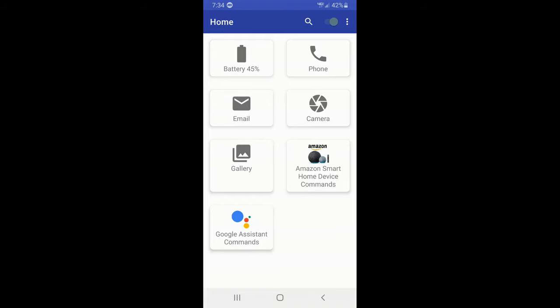Smart Home Helper is a no-cost to the user Android app that enables individuals who are nonverbal and individuals with speech disorders such as stuttering, apraxia, and dysarthria to issue verbal commands to control voice-activated smart home devices. Smart Home Helper uses Android's text-to-speech capability to enable users to create, organize, and issue smart home commands using human-sounding synthesized speech in 63 languages.